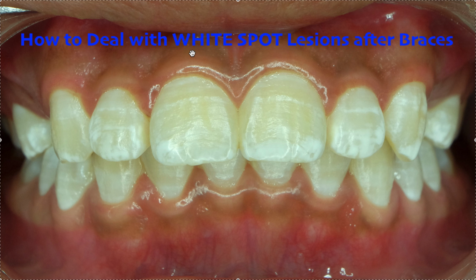So it's going to involve a process of cleaning the teeth, and then mechanically what we're doing with the Icon is we're abrading the teeth, taking off the surface layer, and then allowing a special mixture of resin to go down into the tubules and kind of block and prevent the demineralization from getting worse. And in doing so, it makes the surface harder, it makes it more resistant to decay, and makes it look better. You can repeat the procedure multiple times, and you can check it as you go to see if you're there yet.